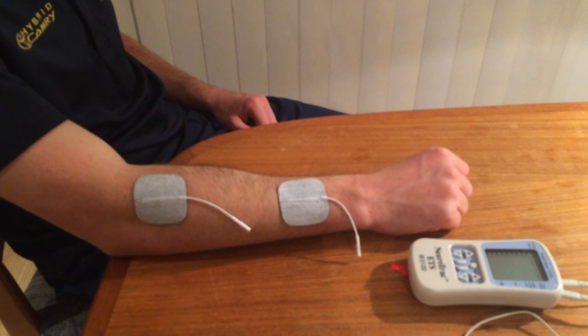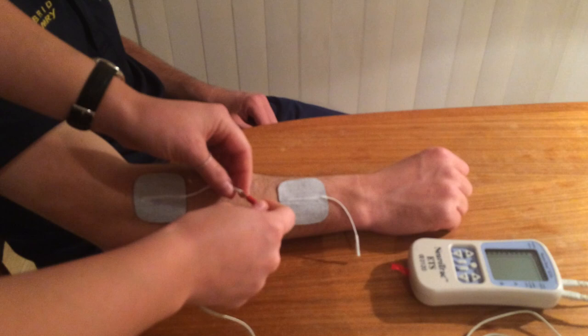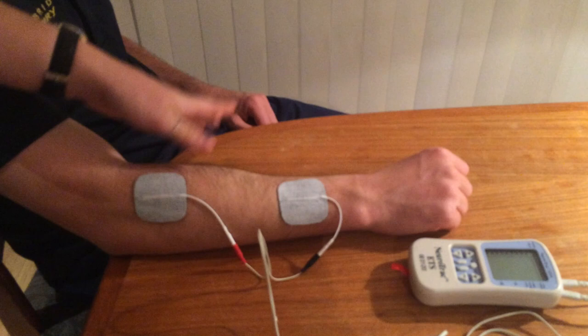Once we've checked the integrity of our leads, we can plug in the electrodes. We're going to pop the red lead into our active electrode and the black lead into our passive electrode, and the same for the wrist flexors.